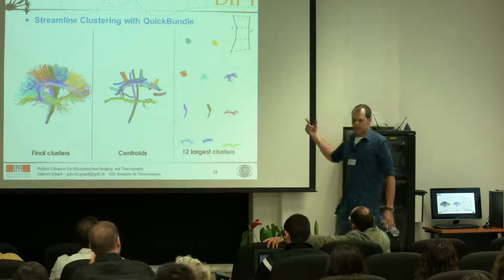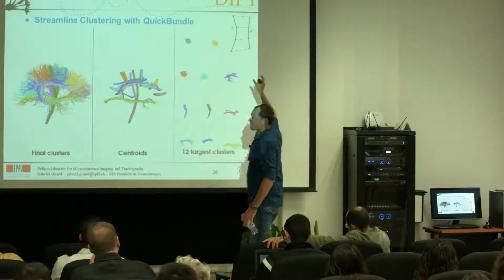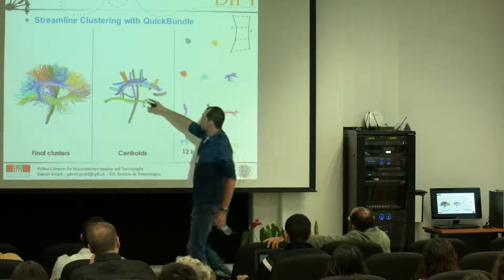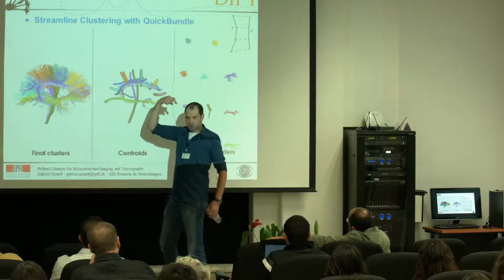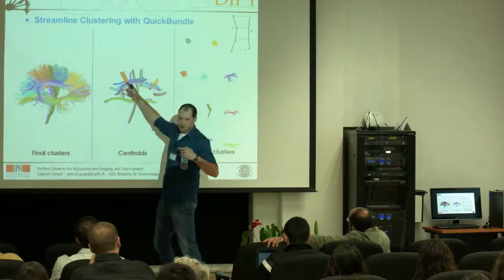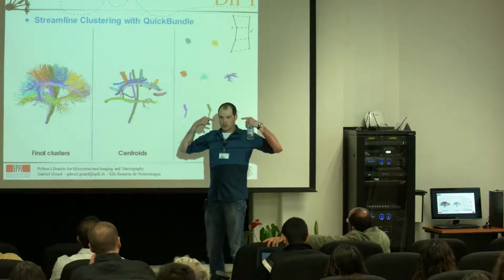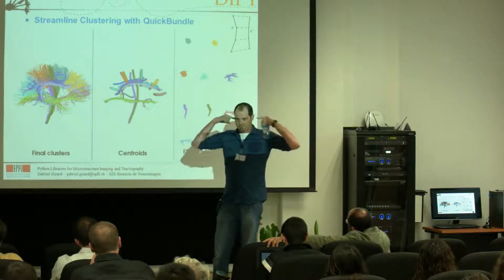It will become many bundles. It really uses only the spatial distances between the lines. So if, for instance, you have a group of streamlines in a U shape connecting the top of both hemispheres, and you have at the same place streamlines connecting the lateral side of the brain, you will have two clusters here. And then based on your threshold, you will have several clusters going from the front to the bottom, to the back.